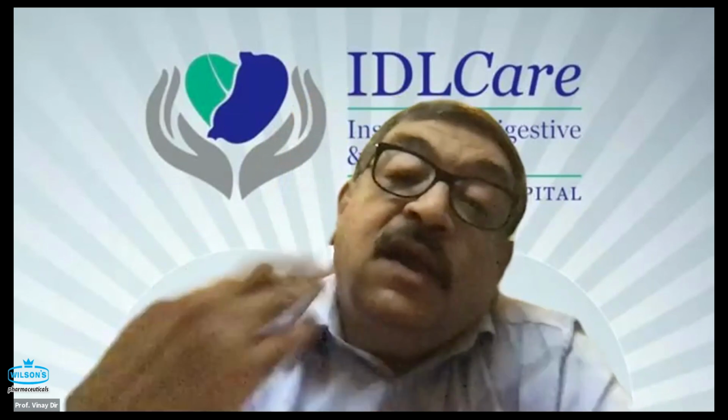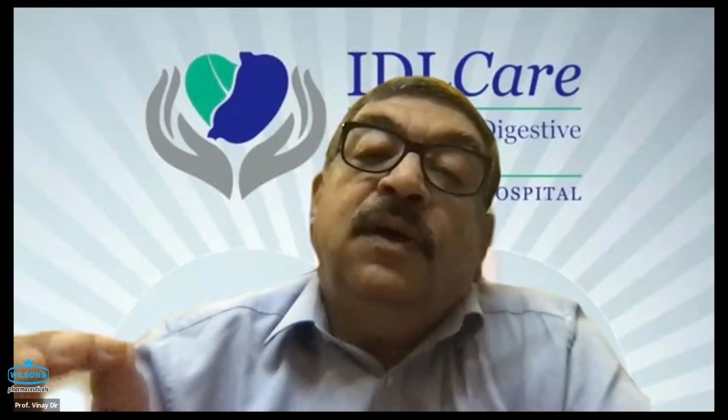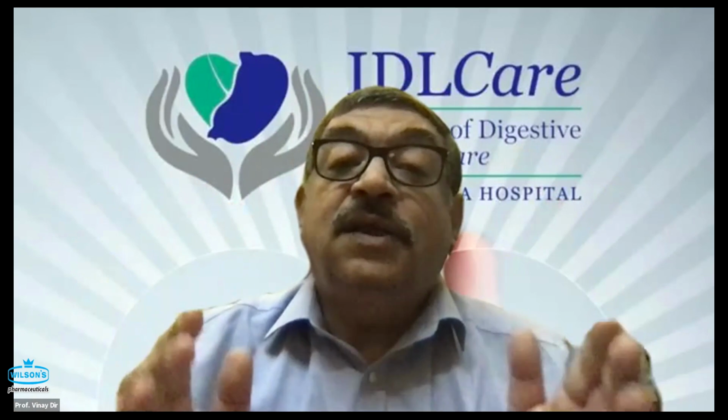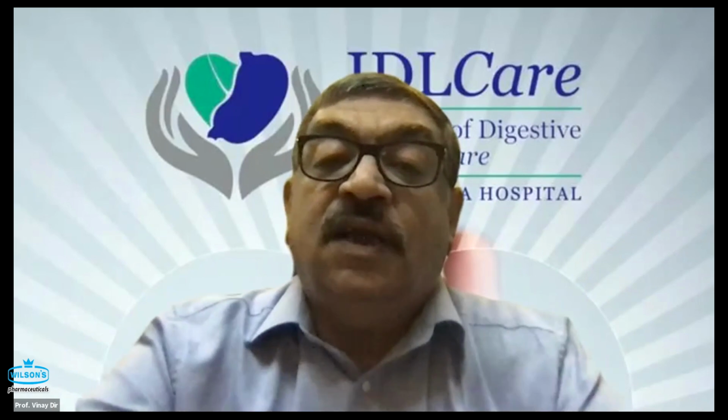So if you can learn to handle the wire yourself, that is the best situation, because you know exactly how much tip should come out. You know when to rotate it, because you are there. Your assistant may not be so much there. If he's good, he has done lots of procedures with you, then yes, you develop a fantastic relationship where he understands you. Otherwise, if you can use your right hand to push the wire gently.